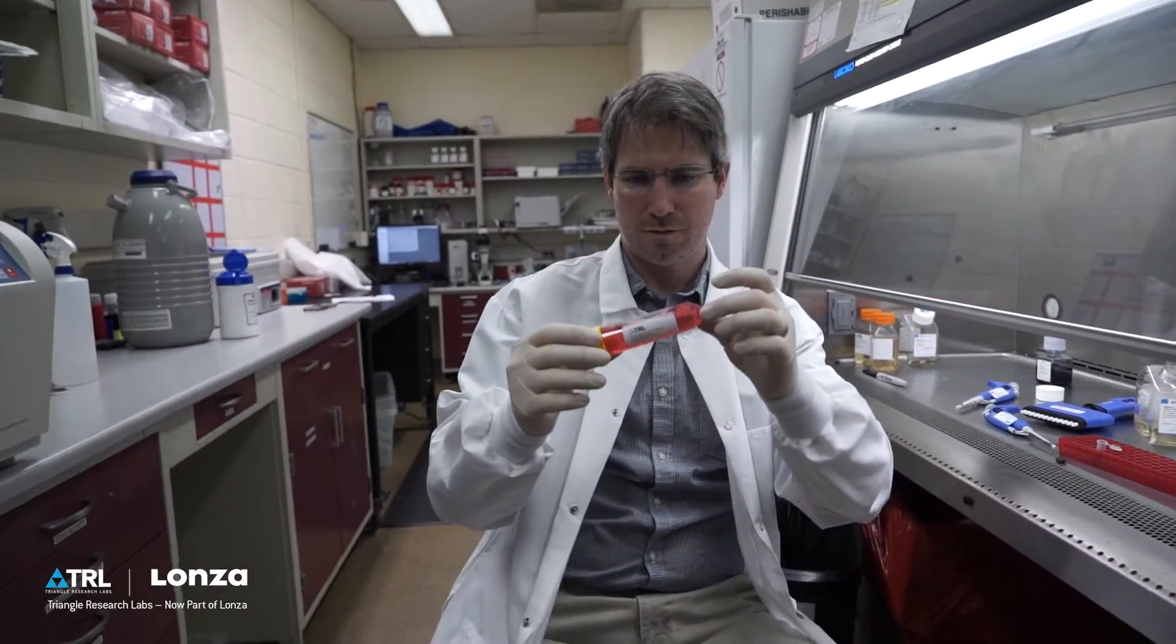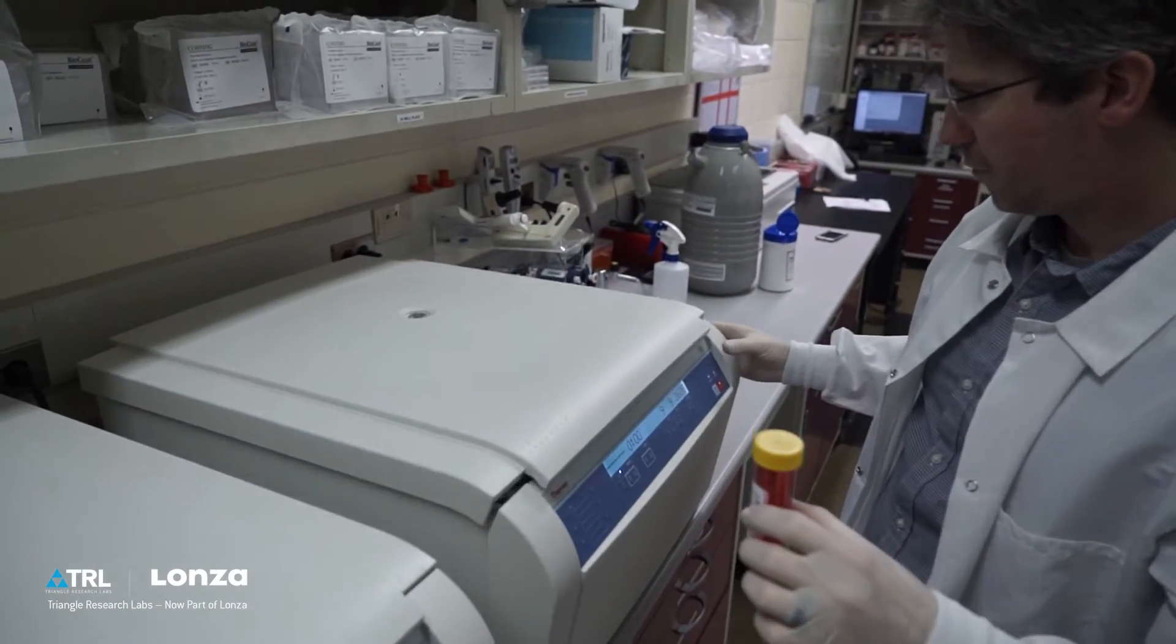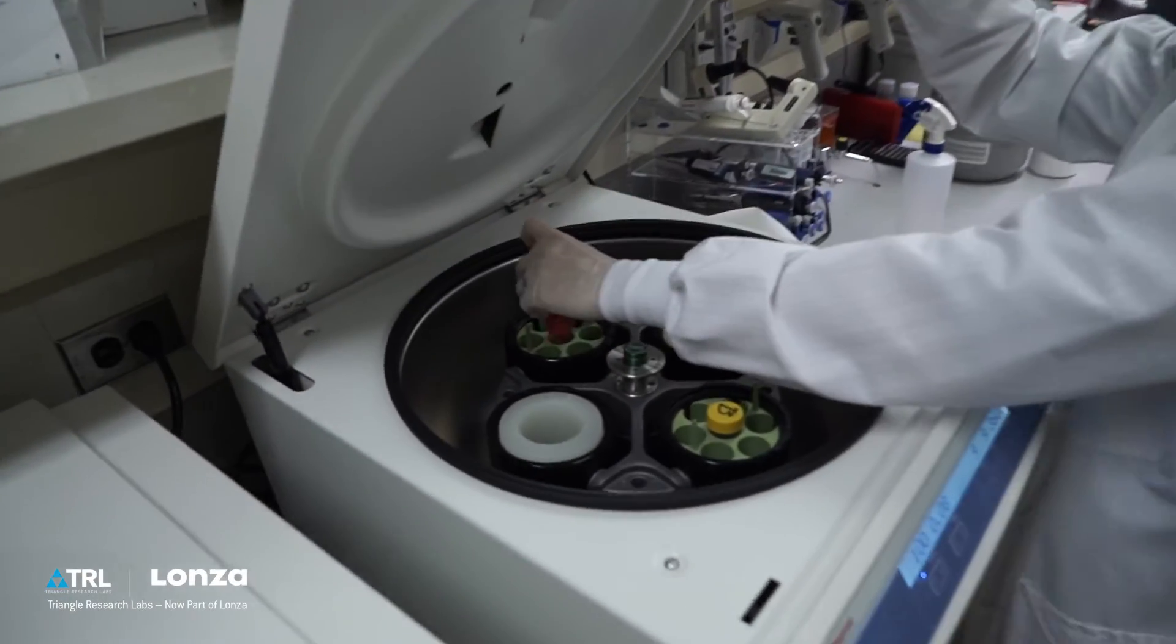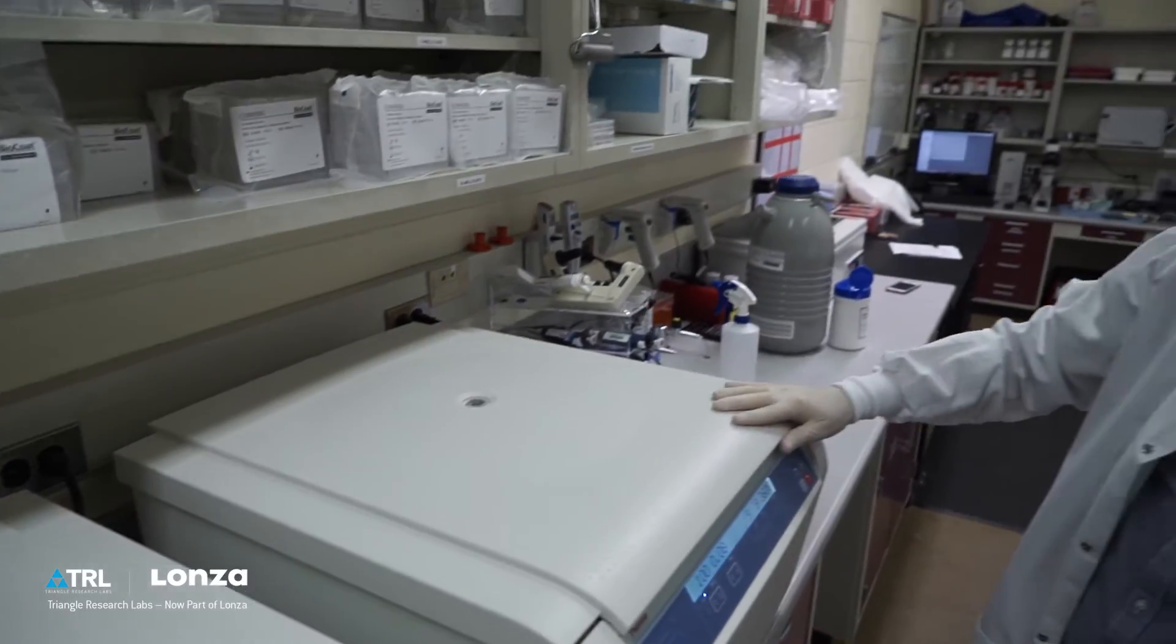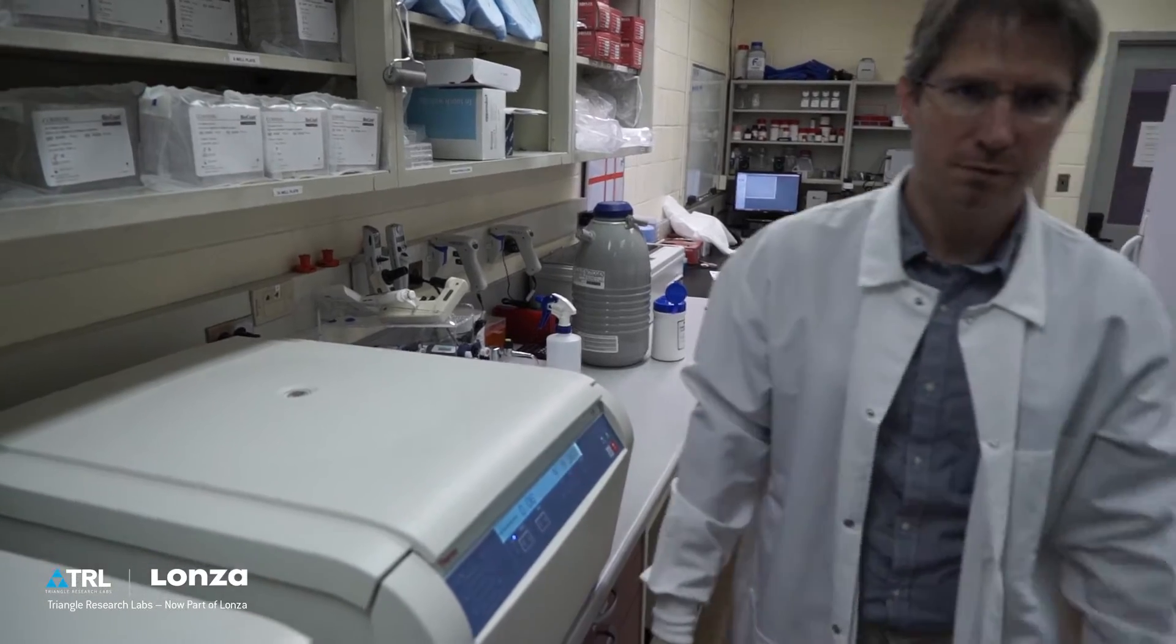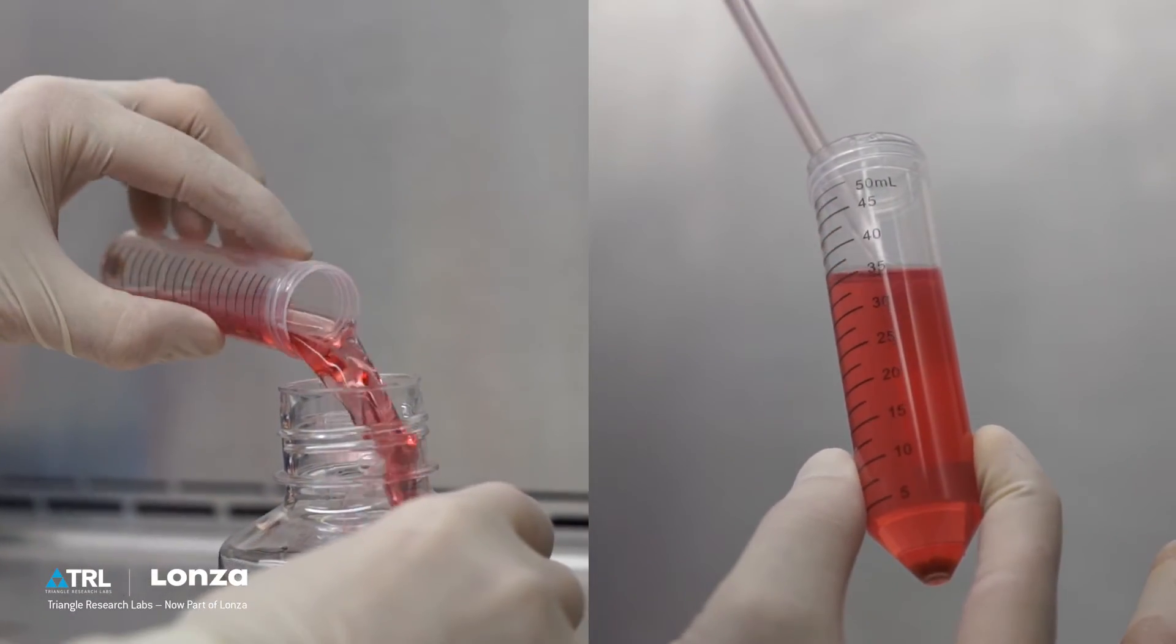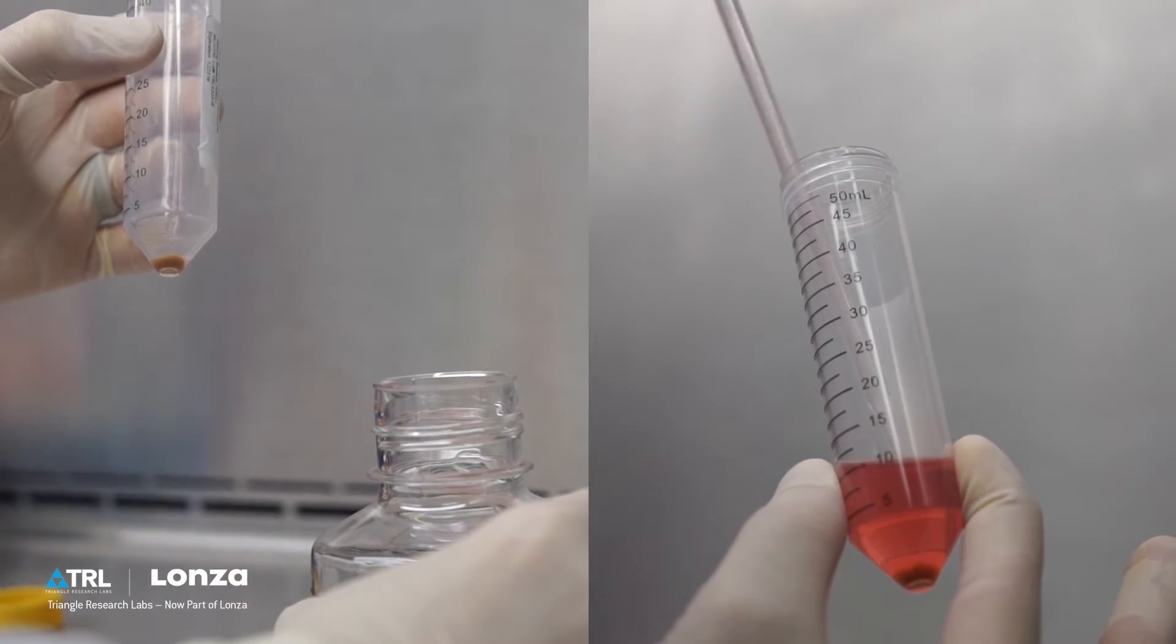Suspend the cells by carefully rocking the 50 milliliter conical tube in your hands for a few seconds. Centrifuge the tube at room temperature following spin speed and duration guidelines in the protocol. Remove the tube from centrifuge, disinfect and transfer to the biological safety cabinet. Pour supernatant into a waste bottle or aspirate away.